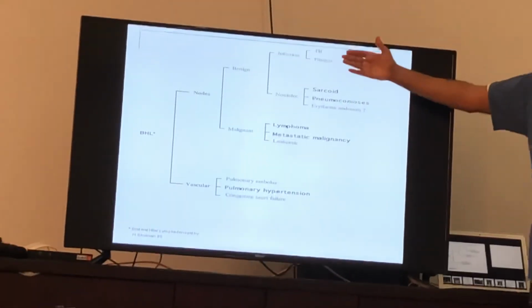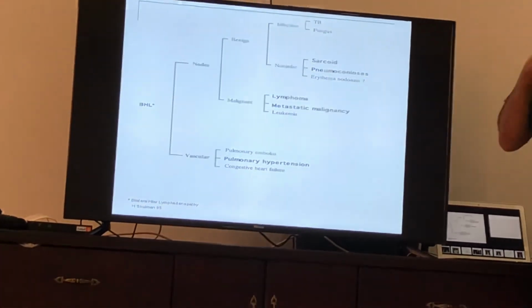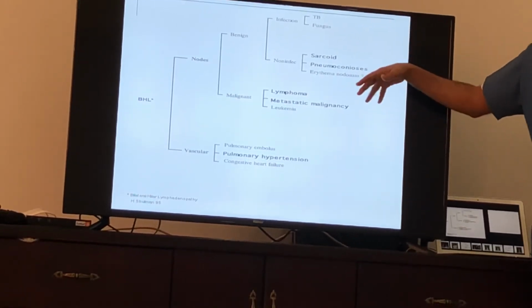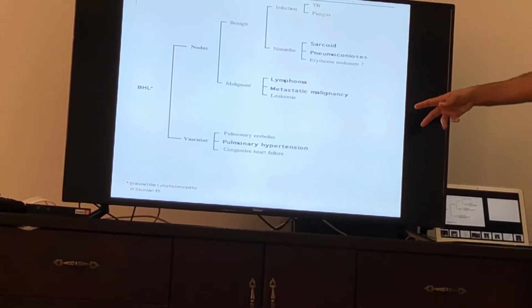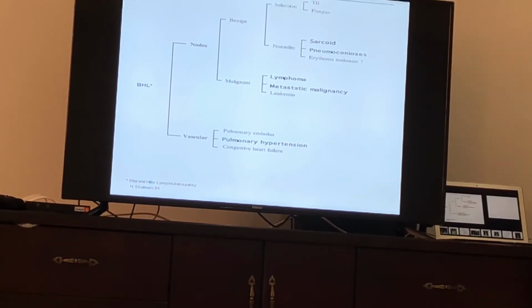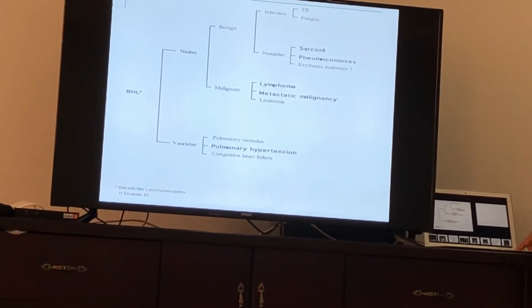Bilateral hilar adenopathy, as you said, could be TB, sarcoid, pneumoconiosis, but those tend to be more calcified. Both can cause calcifications. Any granuloma or pneumoconiosis causes calcification. It could also be lymphoma or metastatic malignancy. If it's actually vascular, not true. It could be, but it's totally not the picture you saw. If it's sometimes early or mild, or one lymph node unilateral, yes, you would put a differential. But mainly it's lymphadenopathy. It's lymph node related.